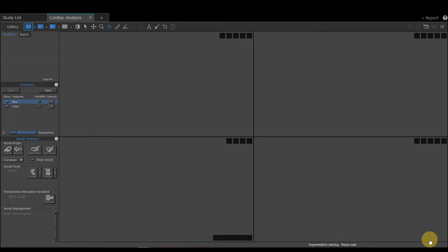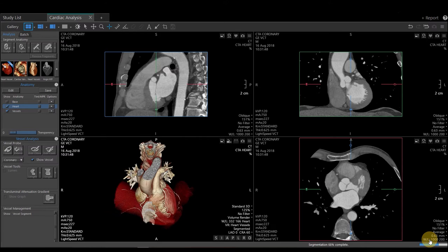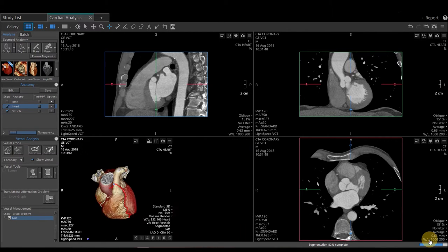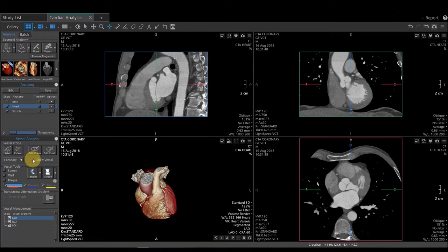Now this particular application will go through and probe out some of our cardiac vessels. That's not really of interest for me on this particular workflow, so I'm going to come to the left-hand side under Vessel Analysis and turn off Show Vessel.